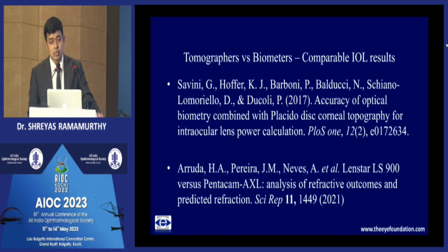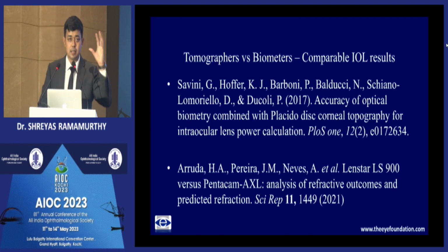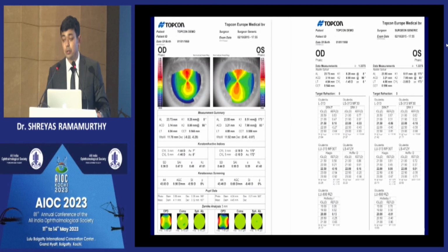And multiple studies have compared different devices, that is the Scheimpflug devices, which provide the axial length, versus the classic biometers, and they have found that the results are quite comparable, and you can use any of these devices.